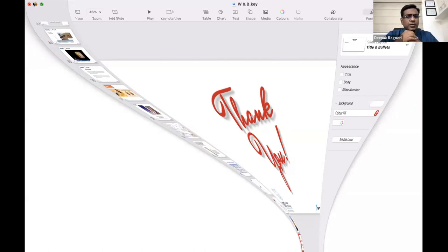The length of the basket primarily comes into play when you're using a flexible ureteroscope, because the shaft length is quite long compared to your semi-rigid short 8 French ureteroscopes. You need a much longer basket when you use it in flexible ureteroscopy or in the longer 45 centimeter semi-rigid ureteroscopes. It is primarily about the length of the endoscope that you're using versus the length of the basket. But otherwise, the engaging capacity is more or less the same. Yes, you can use it. Sure, sir.